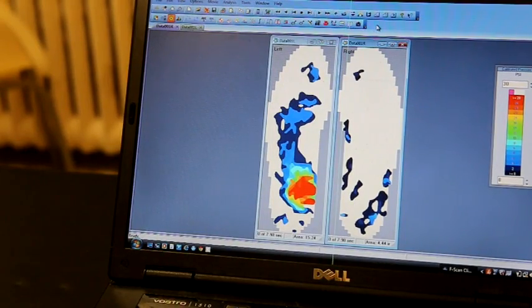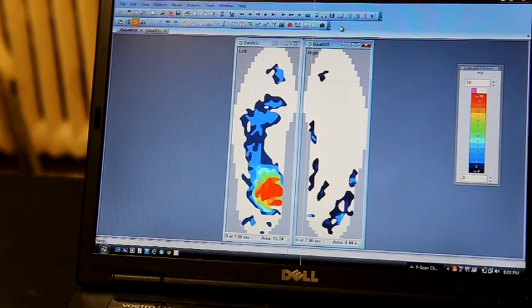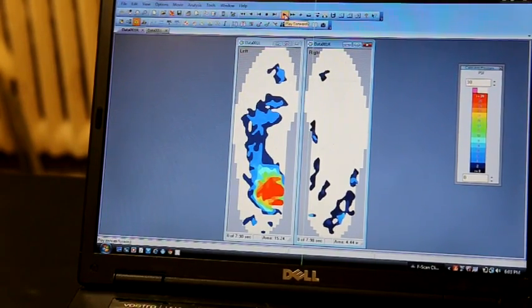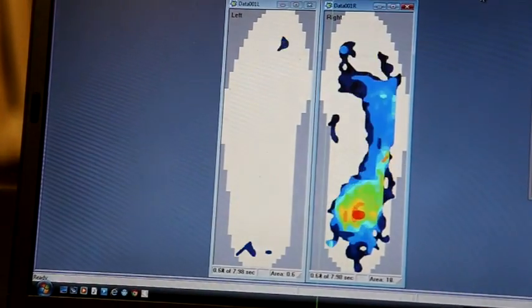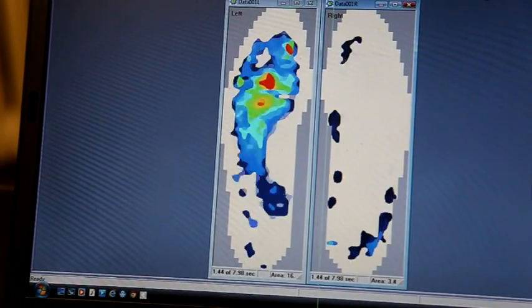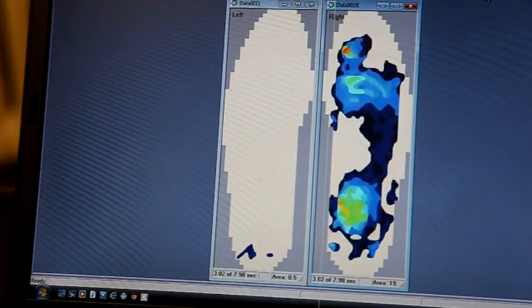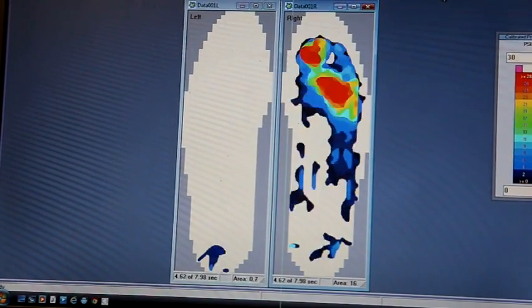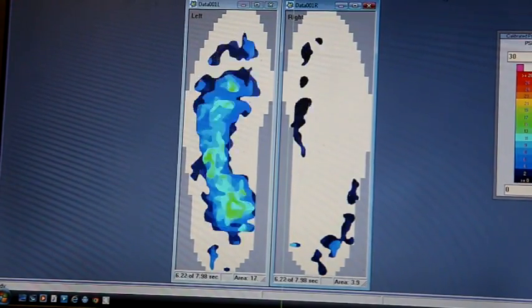So now we're going to show the gait investigation for our subject that we just recorded, and we're going to show it as a brief movie here in the recording, showing all the different foot pressures collected in the foot during the investigation. So here we see the movie playing, and we see the red colors are high pressure, which typically accumulates in the forefoot, near the ball of the foot, near the toes, and also in the heel. This is a very common type of gait pattern that we see very often. Patients exhibit pain in the heel and also in the ball of the foot.